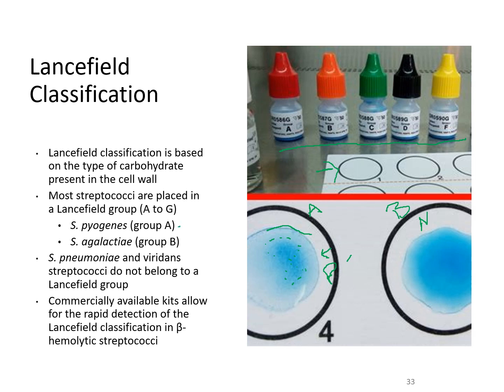then we did the Lancefield typing here for our group A S. pyogenes. Strep pneumo and viridans streptococci do not belong to any Lancefield group, so this test would not be useful for those. Once you look at your hemolytic pattern and you're trying to decide for sure if it is one of these particular organisms, then you would test it against this reagent to help narrow down what organism you're working with.